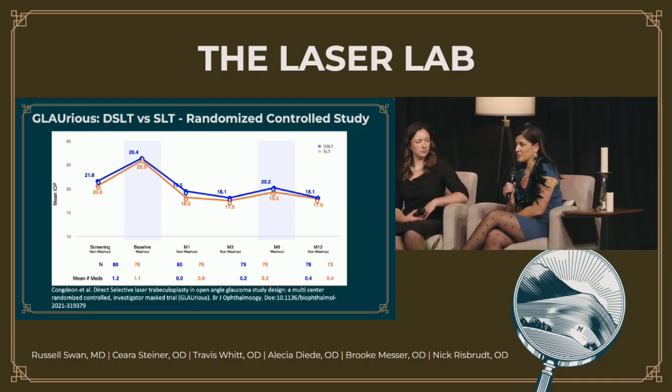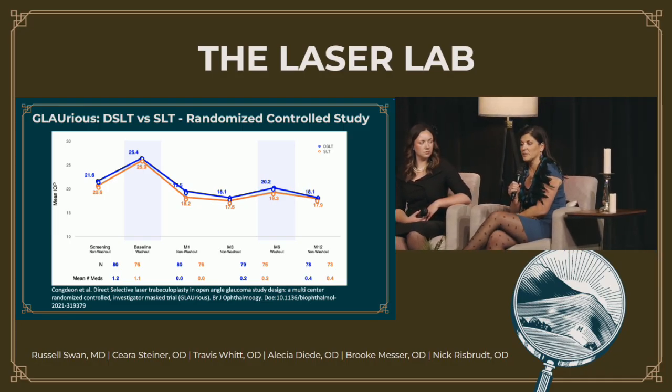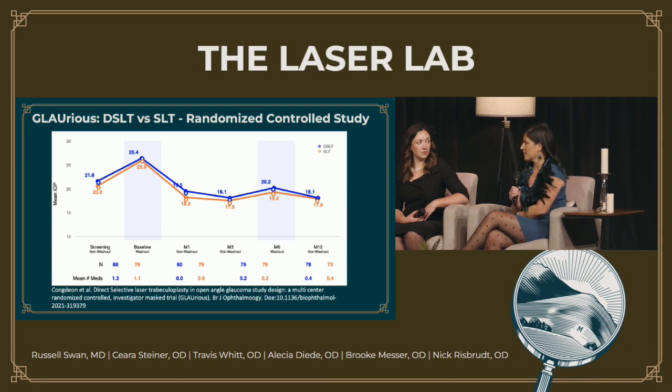In fact, our patients don't even sit down. They literally walk in and put their chin in the chin rest, and then they sit back. It is so fast. I've watched Mike do a few of them, and I don't even know if we use the lid speculum, because that's how fast it is. But I'm assuming we must, so that it can detect the limbus. Basically, the surgeon will see the eye on the screen, and you tap around it, and it identifies the limbus, and then once we're happy with the identification of the limbus, you basically hit fire.